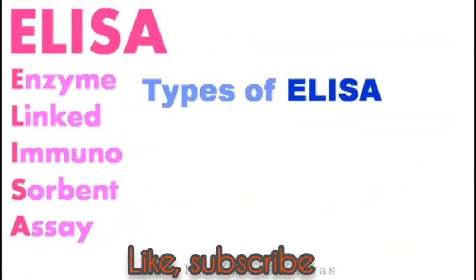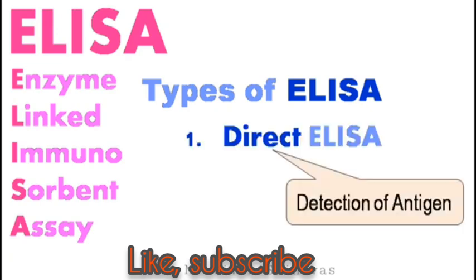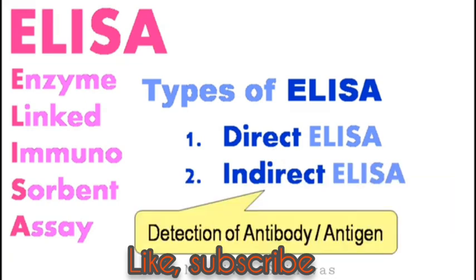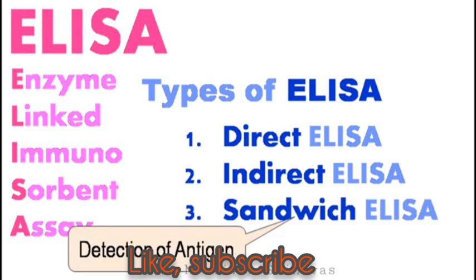This test can be done in 3 different ways, depending upon the purpose or need, and are described as: Number 1. Direct ELISA, used for the detection of antigen. 2. Indirect ELISA, used for the detection of antibody, or antigen, but used mostly for the detection of antibody. And lastly, sandwich ELISA, used for the detection of antigen. We will discuss in detail about each method.